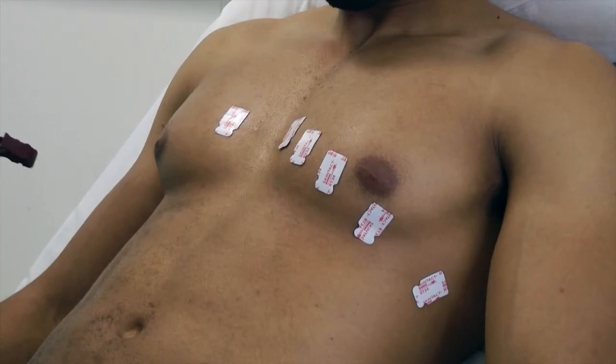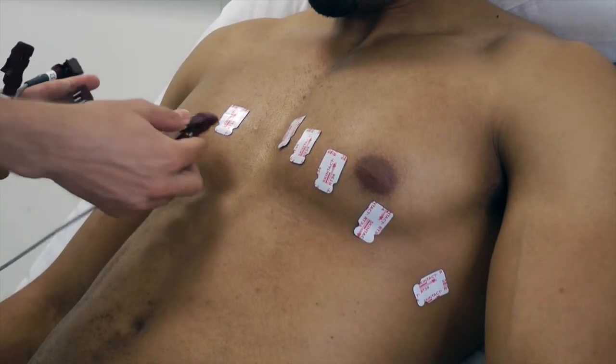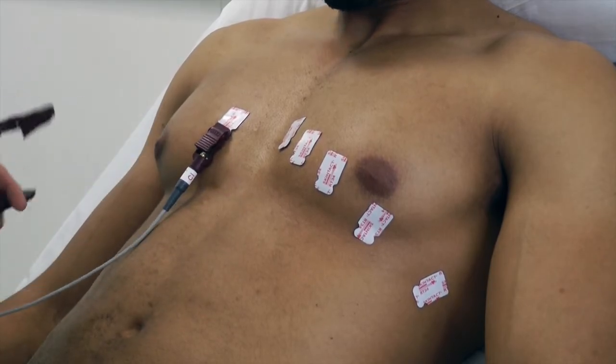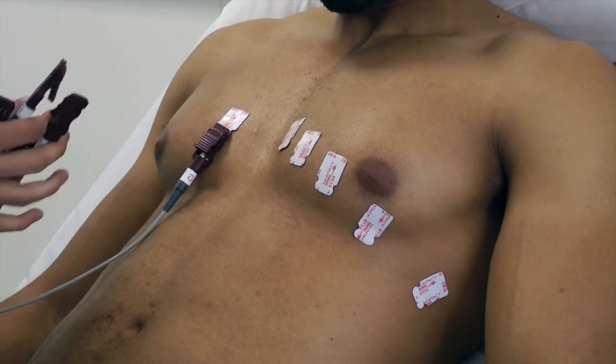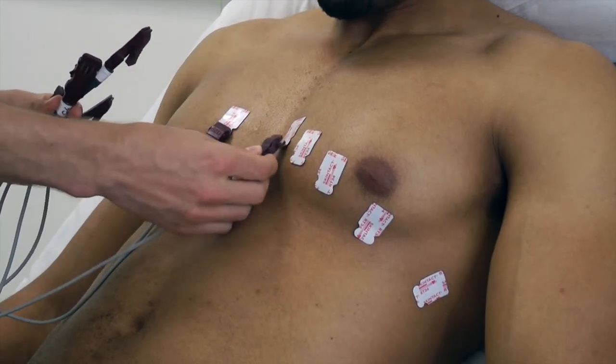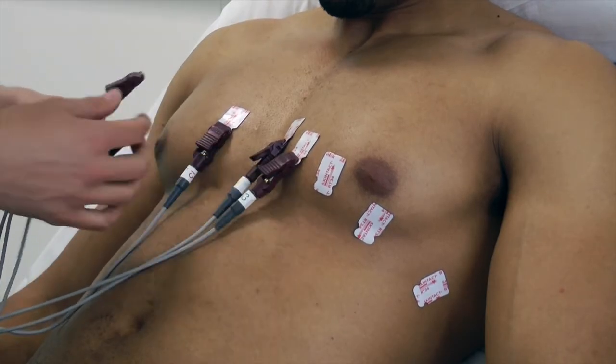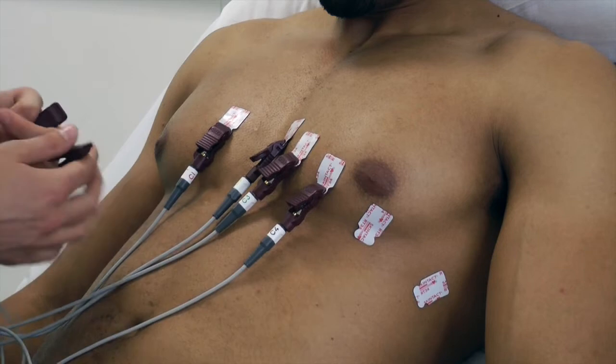Tangling the leads is easy, especially in an exam. A tip is to pop the centre block on the patient's lap — this is the central point — so remember the leads are tight and may pull off the stickers. Attach the limb leads first and then attach all of the chest leads in order.